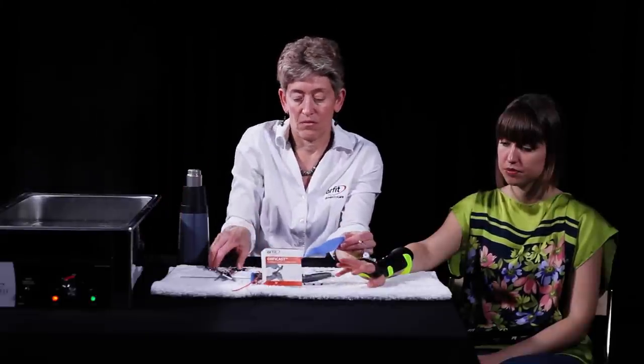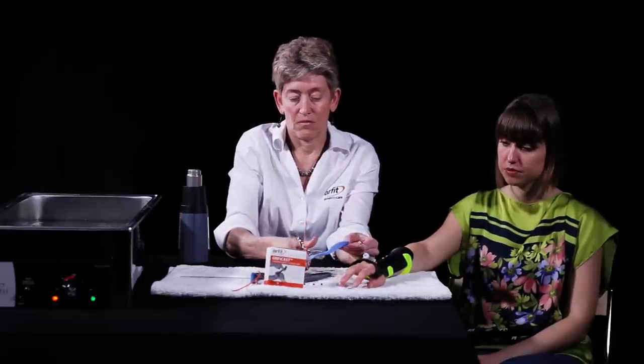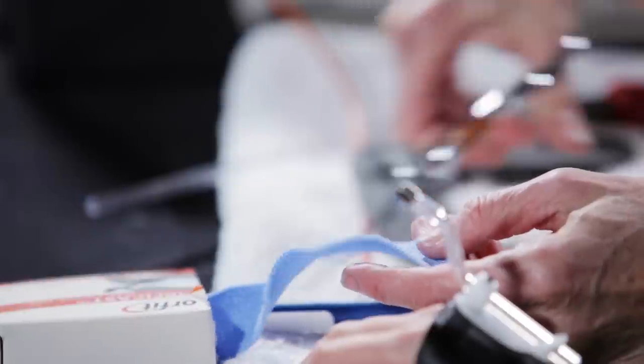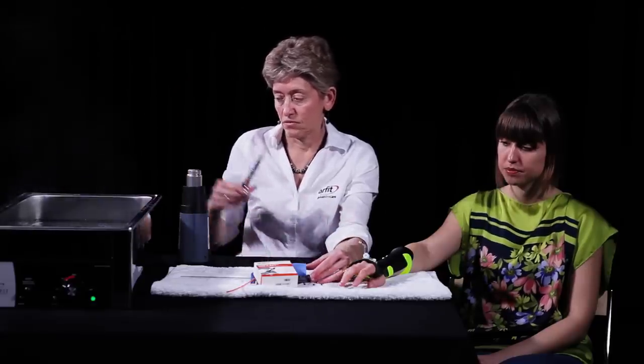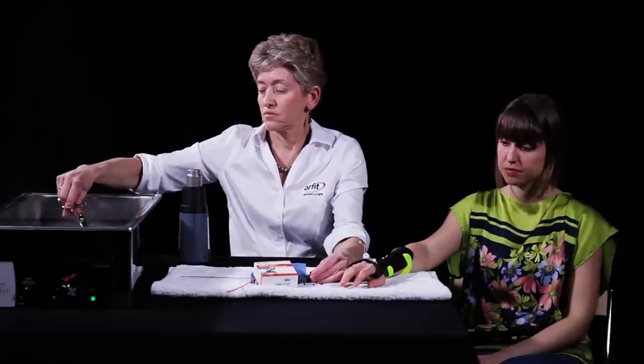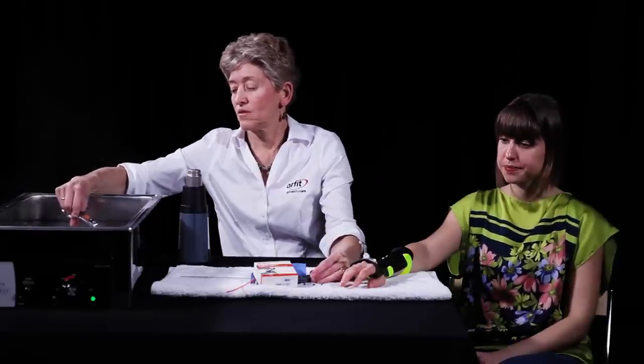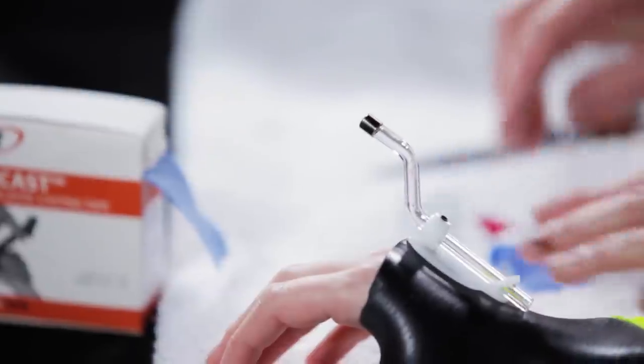OrfiCast will be used to make the finger cuff. Cut a piece of OrfiCast about 3 inches long. Heat up the OrfiCast in the splint pan to activate. Remove and dry briefly.